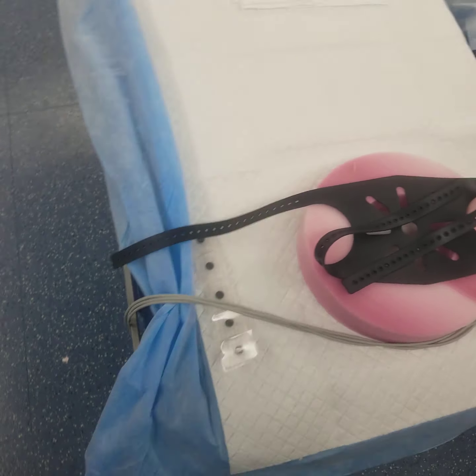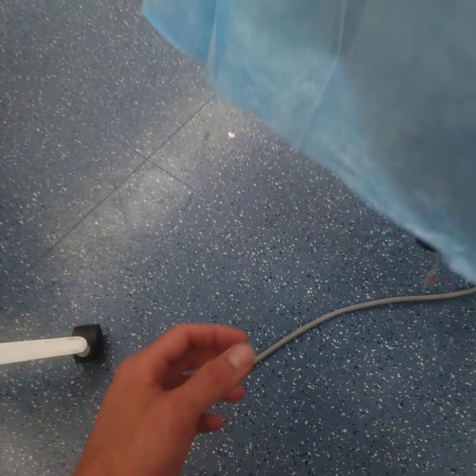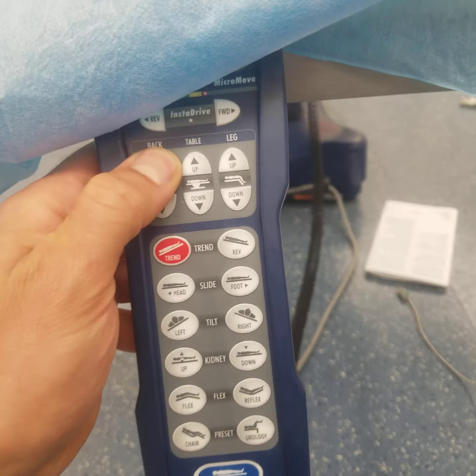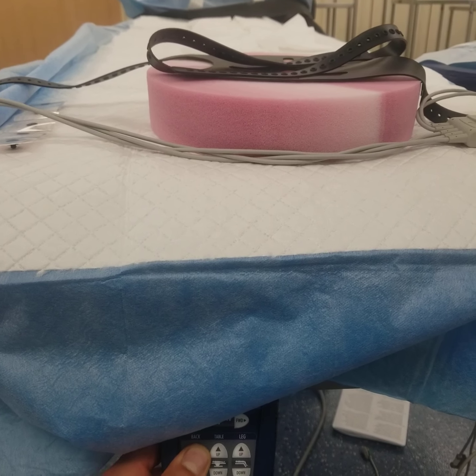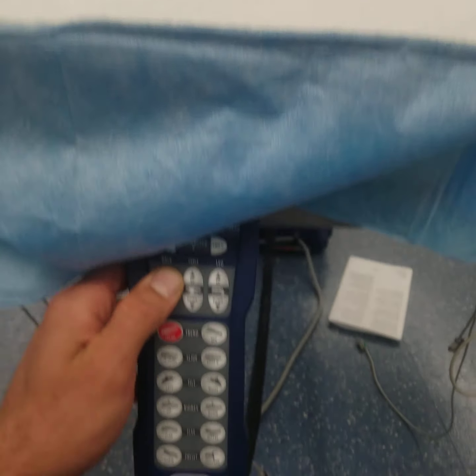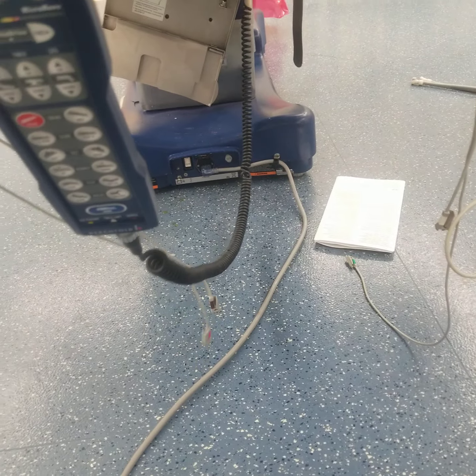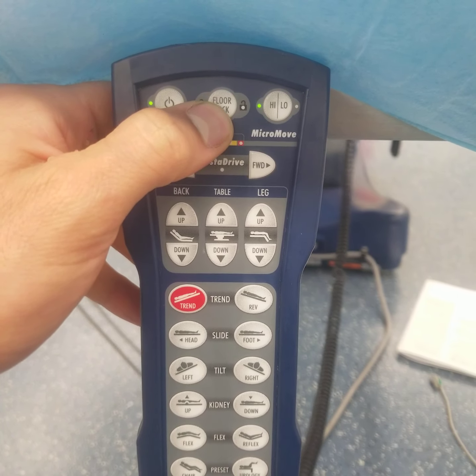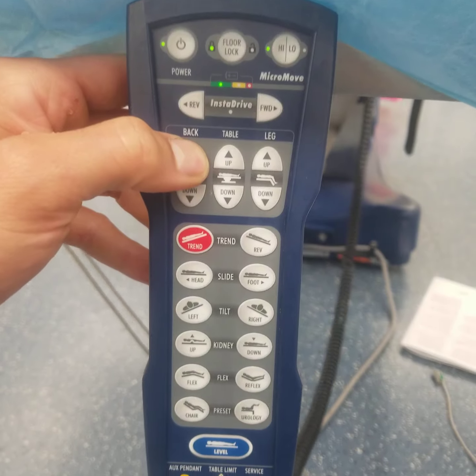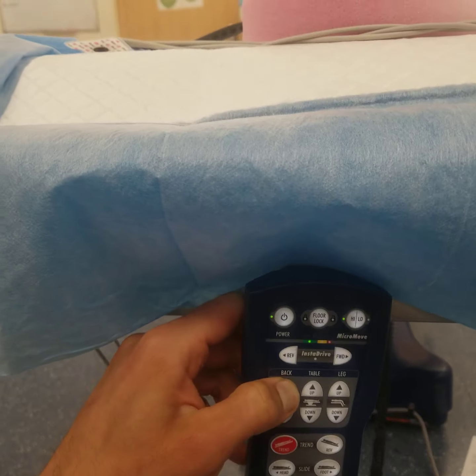Most people do not tolerate being flat if they can avoid it. So if we can find the clicker, I'll go up on the bed and sit their head up just slightly. And I don't think we're working. Okay, so actually what just happened was the bed was not locked. So I found what could have been a serious issue was the bed was not locked. Now the bed will go up. The bed will not move up or down unless it's locked. It's one way to know.